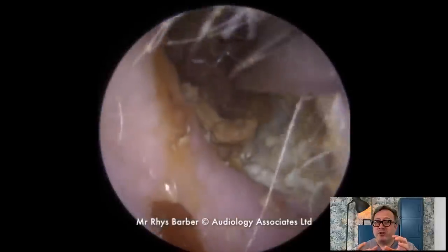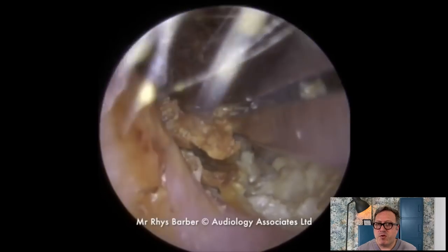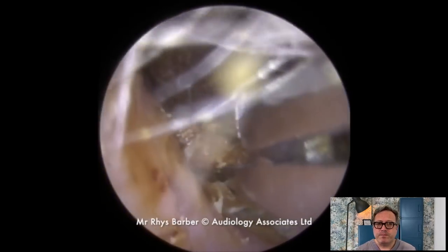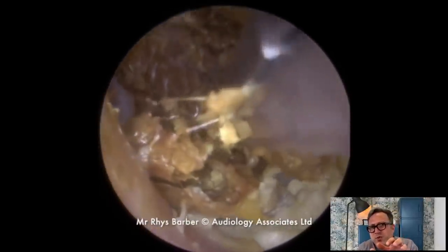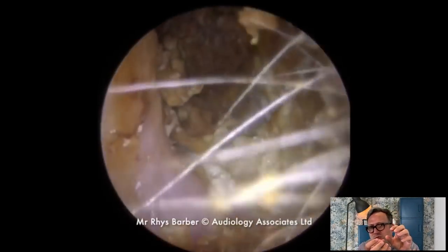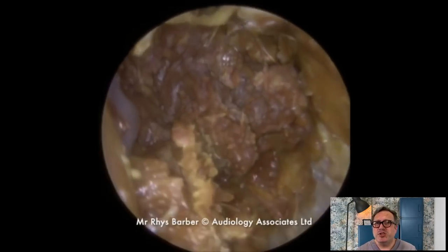Sometimes you're lucky and you get quite a large plug coming away. We did do an explanation video of this type of problem as well, which is in our history, so you can take a look at that. Just trying to get a grip — watch the forceps as we go in. As they clamp down, because the wax is soft and wet, it kind of breaks apart at the sides and just shears straight through it.